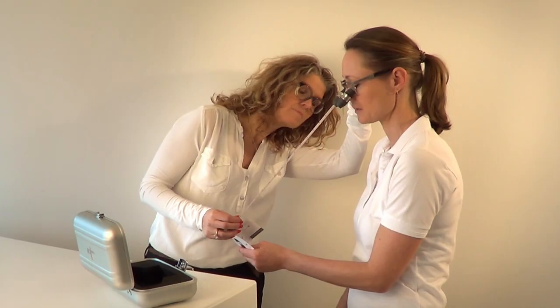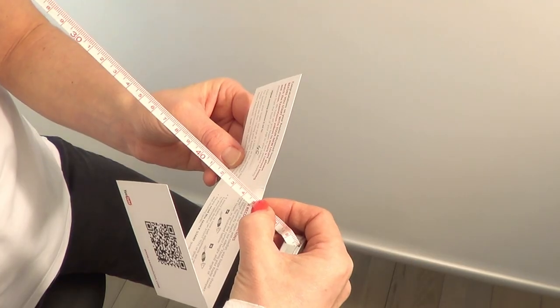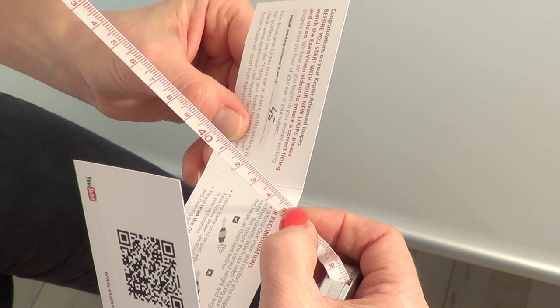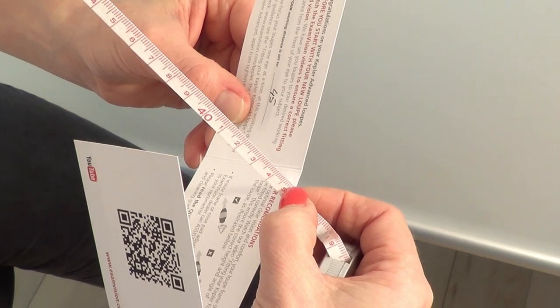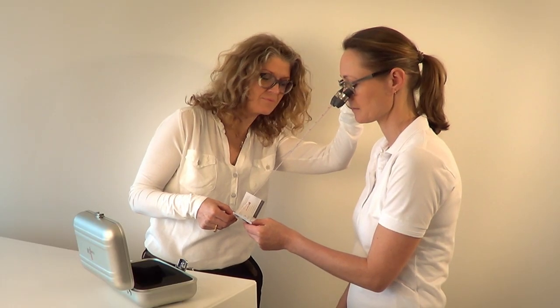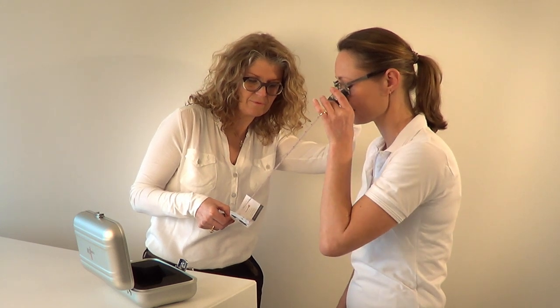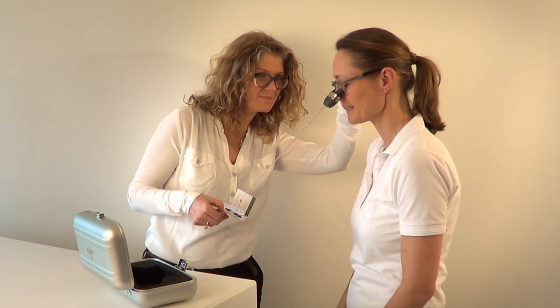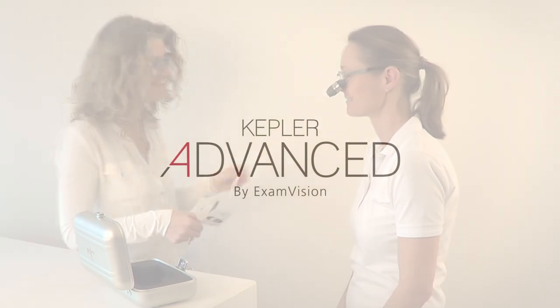Then close one eye so you're only looking through one ocular. Gently turn the outer carbon ring of this ocular until you achieve the sharpest image. Repeat for the other eye.